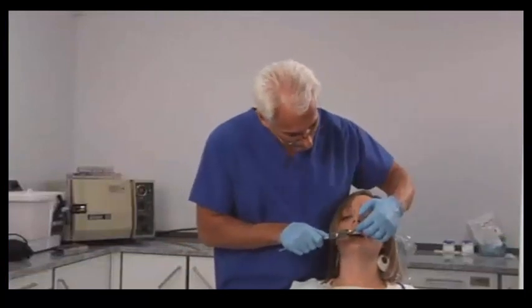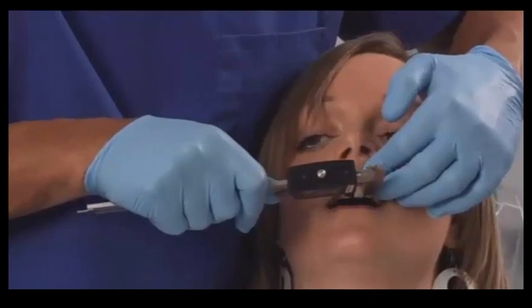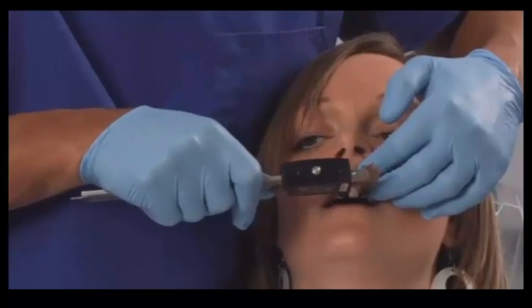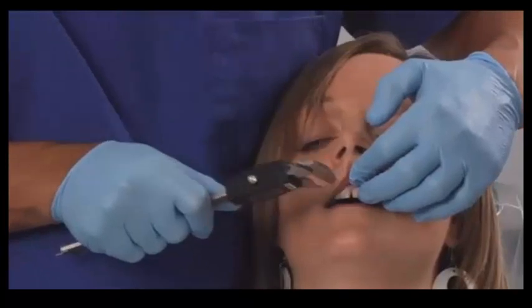So I'm going to just measure you with this digital caliper. So I'm measuring both central incisors, and Caroline has a diastema, so I'm going to measure half the diastema as part of her calculation for her central incisor width. I'm going to enter that into her patient file.